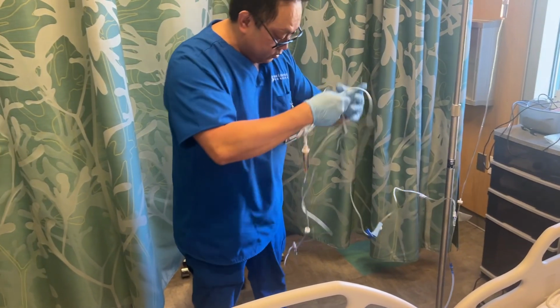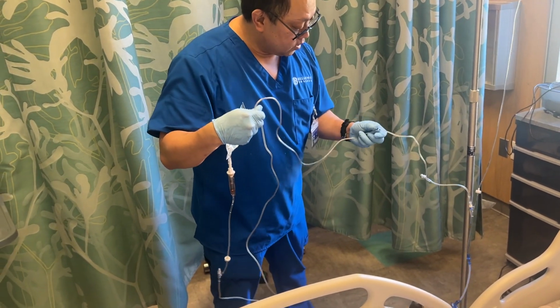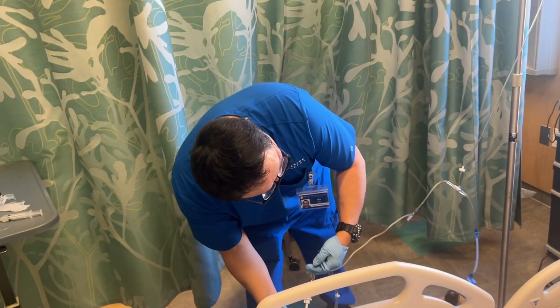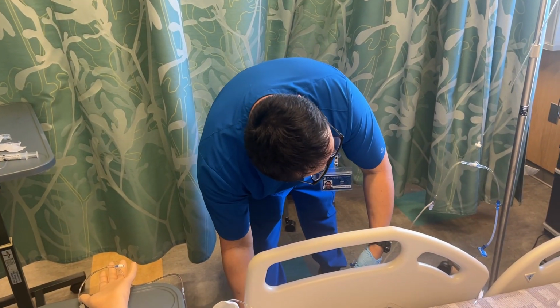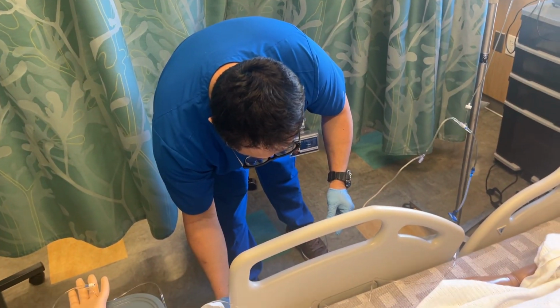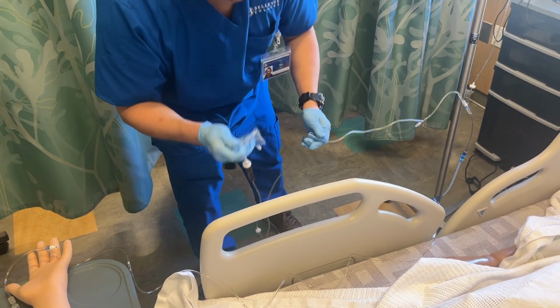But also I need to unlock this so we can back prime it. So we'll unlock this. And there we go. It's flowing in. All right. So I'm going to lock this again.